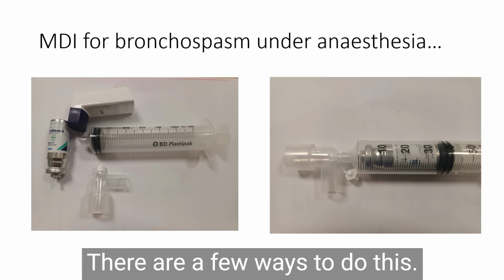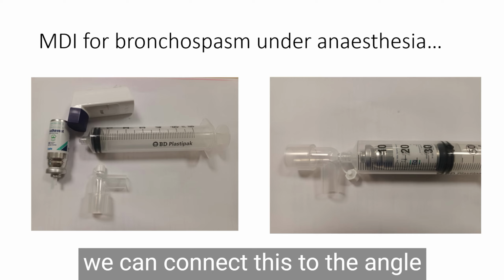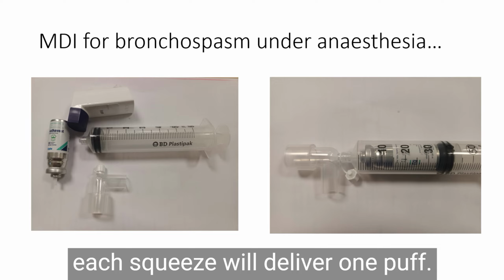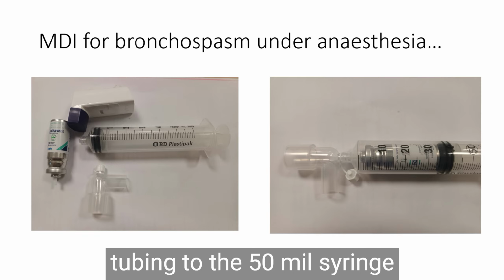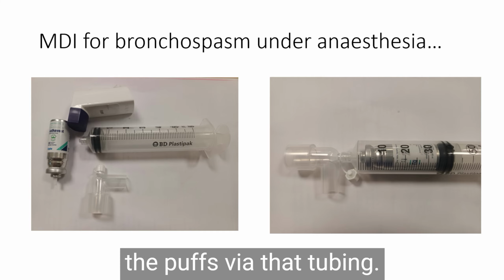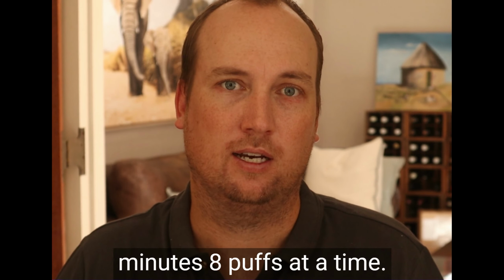There are a few ways to do this. One can place the canister of the salbutamol in a 50 ml syringe, and we can connect this to the angle piece of our breathing circuit and then squeeze on the syringe, and each squeeze will deliver 1 puff. Or one can connect some tubing to the 50 ml syringe and then pass that down the endotracheal tube deeper into the airway and administer the puffs via that tubing. We can repeat these salbutamol doses every 5 minutes, 8 puffs at a time.